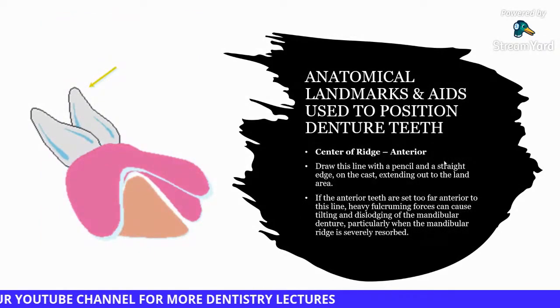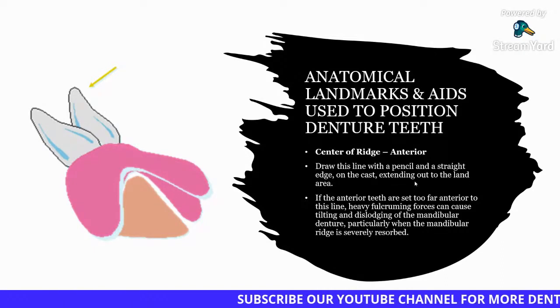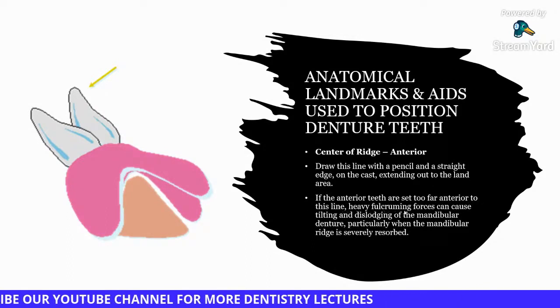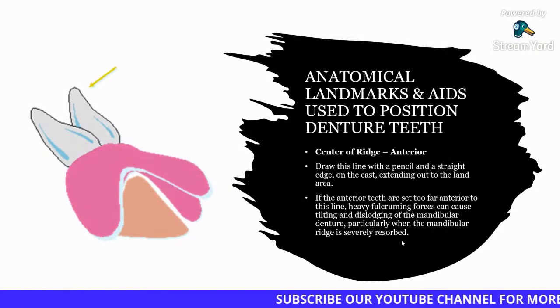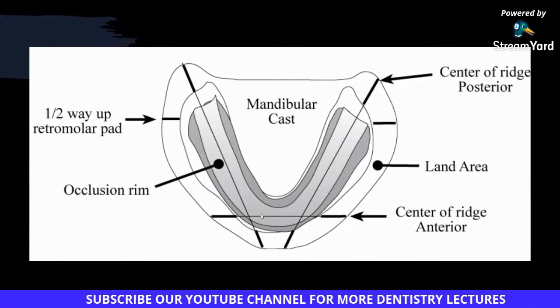Similarly, for the lower anterior, here we draw a line with a pencil and a straight edge on the cast extending out of the land area. If the anterior teeth are set too far anterior to this line, heavy fulcruming forces can cause tilting and dislodging of the mandibular denture, particularly when the mandibular ridge is severely resorbed. So this is the line we have to set.